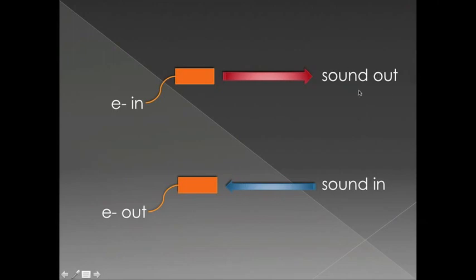The other critical part of this is that if you have a sound signal that comes back in to the crystal, when the crystal vibrates, it actually produces an electrical current. And because you have something that transmits and also receives, it's called a transducer. So this is the most basic element of any ultrasound transducer: one crystal that sends out sound when it has an electrical current applied to it, and then when a sound wave comes back and hits the crystal again, it produces another electrical current.